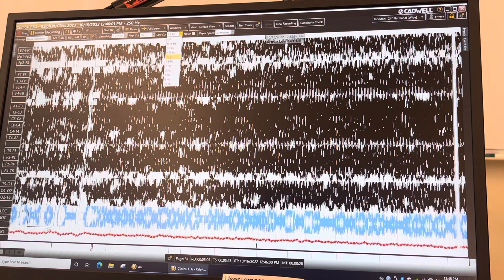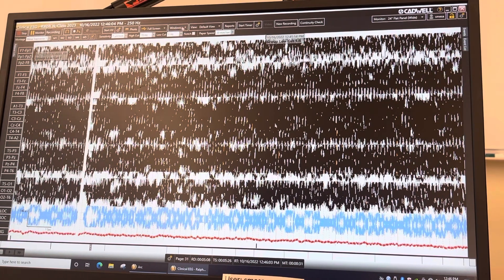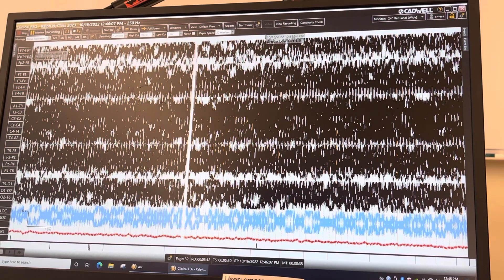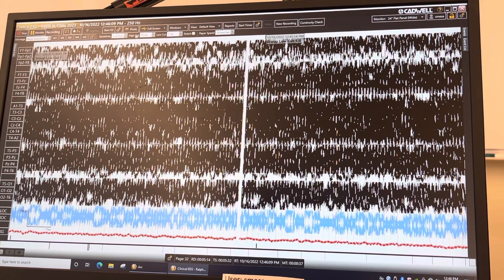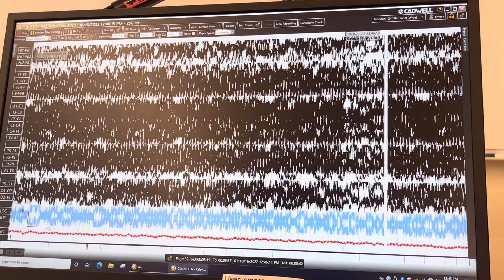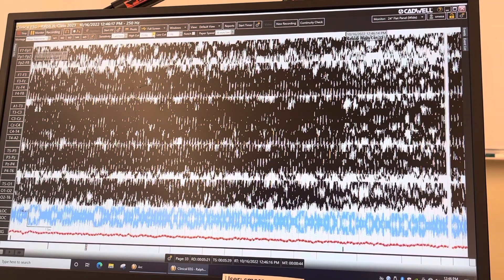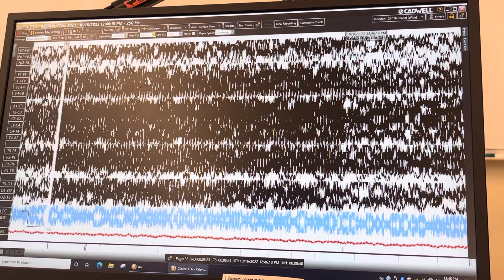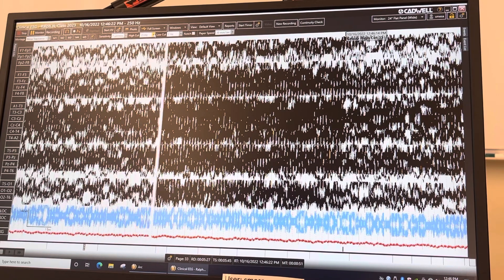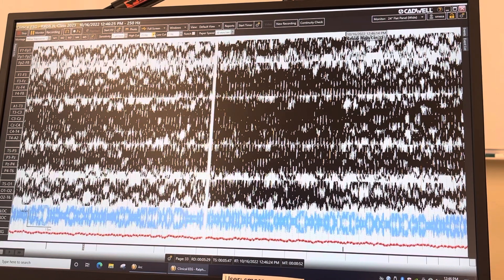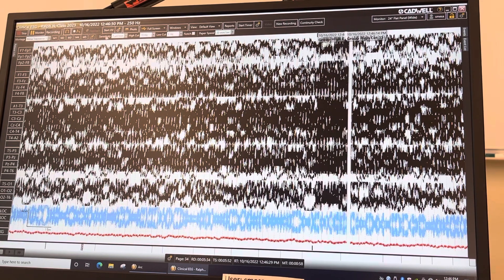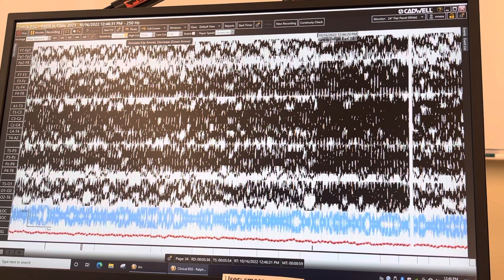Turn the low cut back to 1, which is the standard setting — that's where it should be at the start of each recording. For the high cut, click on it and go to 35, which will decrease the amplitude of fast activity on your EEG. Then go back to 70.